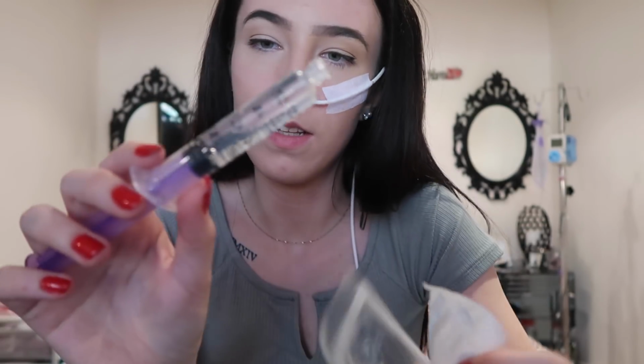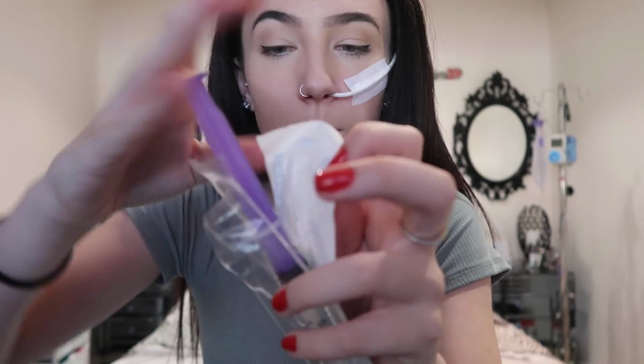I have about, what is that, 9 mils in there. So I'm just going to put that back in there to keep it fresh. And I'm also going to take this one with me, and we're just going to head to the sink and wash off the tube, which is now quite dry from being in the tissue. I'm going to take some fresh tissues to put the tube back in.